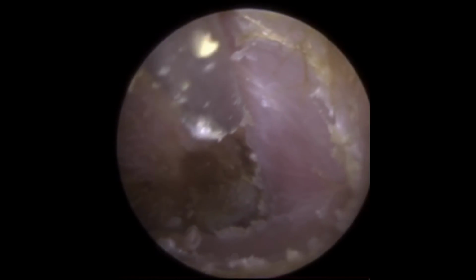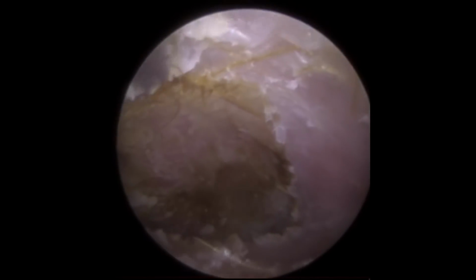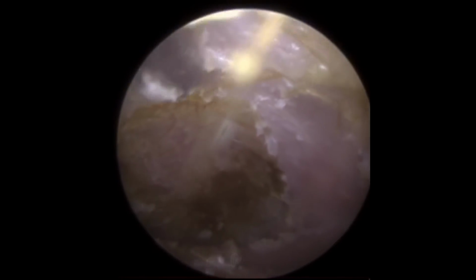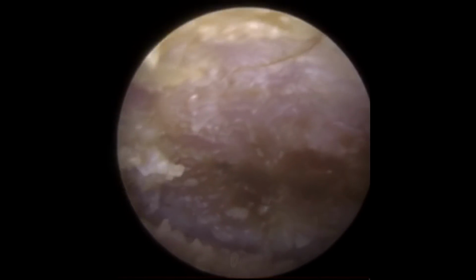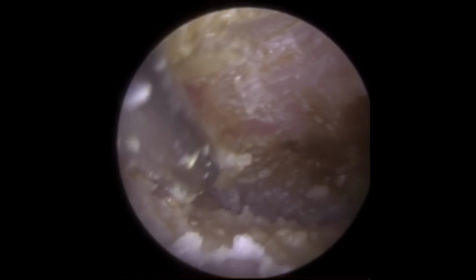I know in America they still use dry mopping quite a lot. Dry mopping is a technique where you get some cotton wool, you attach it to the end of an ear curette, so a Jobson horn or even an ear hook where they've got a serrated tip. You then put the cotton wool into the ear and you spin this cotton wool around and it collects any debris. It's really fallen out of favour in the UK, and for the very simple reason, we advise people not to use cotton buds or Q-tips, not only because you risk pushing and impacting the wax further in the ear canal, but you also risk grazing the outer layer of skin cells on the ear canal itself.